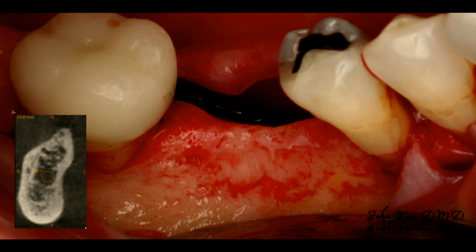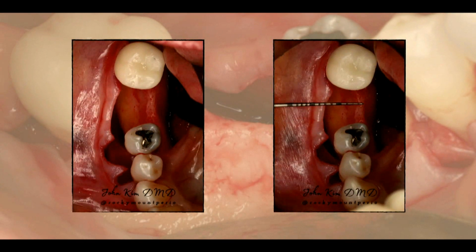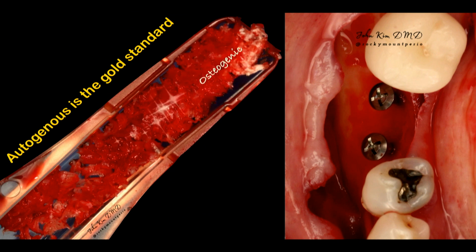And you can see it's almost like a knife edge ridge here. And in the occlusal view here, you'll see that it's, again, maybe 1 millimeter at most in thickness right there. And so I know that this is going to be a little bit more of a complex ridge augmentation procedure. And with all my more complex ridge augmentation procedures in which there's very deficient bone, I'll make sure I always incorporate autogenous because it has the 3 properties that we would like to have in our bone graft.